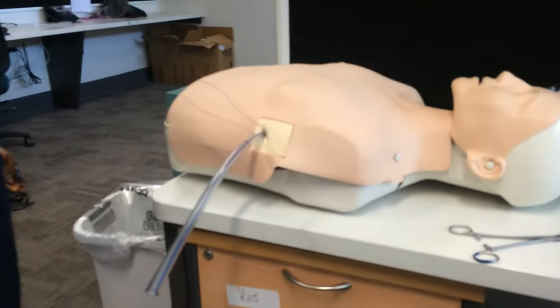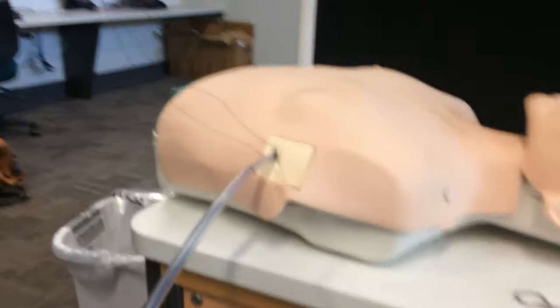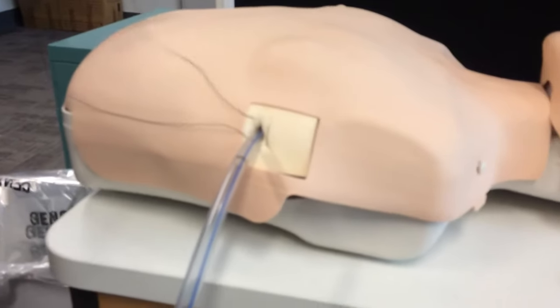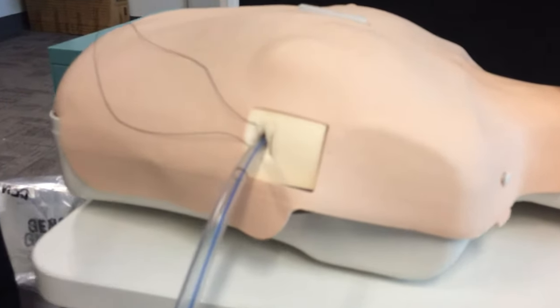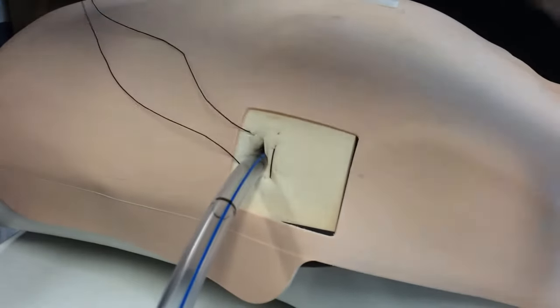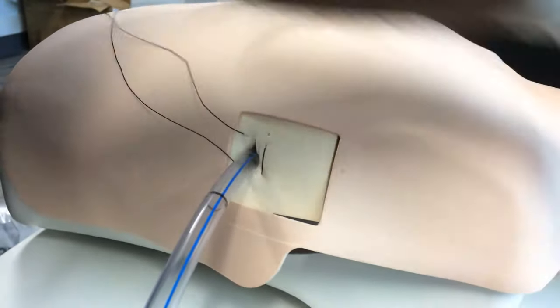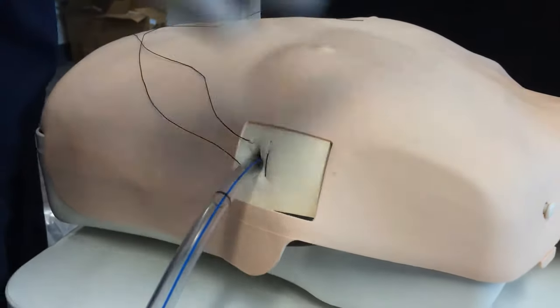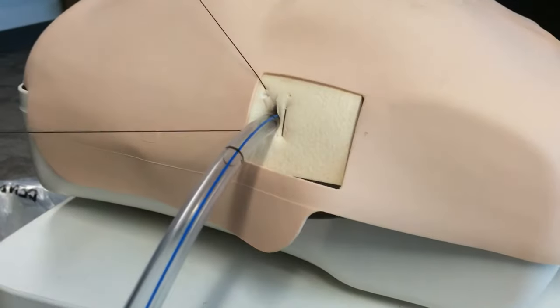This is called the Joburg Knot, and it's taught to me by the pre-hospital doc in the UK. It's a brilliant way of securing your trauma chest drains.